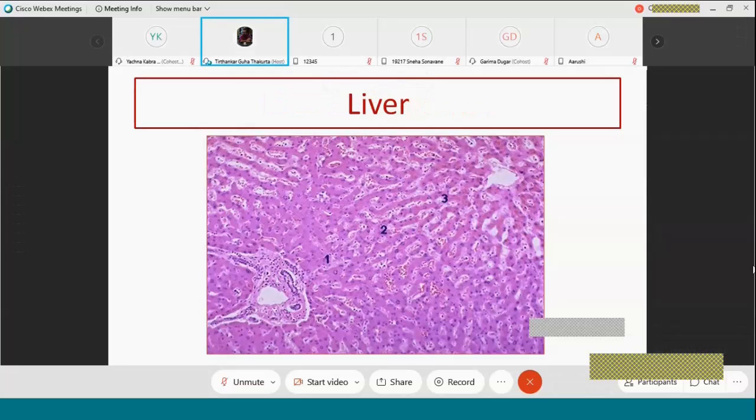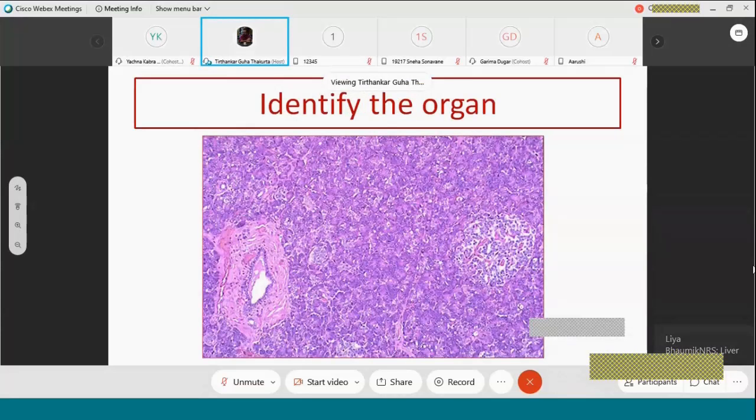What is this organ? Very good. It is an organ showing multiple serous acini that are draining into a duct lined by cuboidal epithelium surrounded by smooth muscles. And there are also clusters of different looking cells with blood vessels in them. So this is probably the pancreas with the exocrine and the endocrine parts.